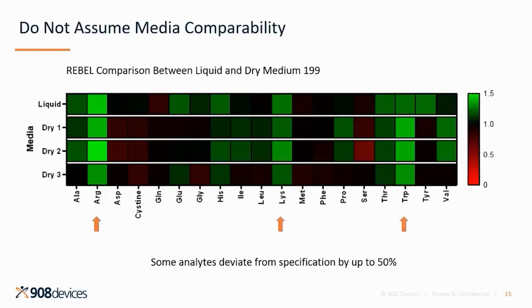When ordering large amounts of cell media, a researcher often decides between pre-mixed liquid and dry formulations. Dry formulations afford the advantages of easier storage, shipment, and costs. However, dry formulations must be mixed ahead of time. This may introduce variation to the composition based on how well directions are followed and the environmental conditions while in storage. The values reported here on the bottom are from the analysis of medium 199 normalized to the specification sheets.